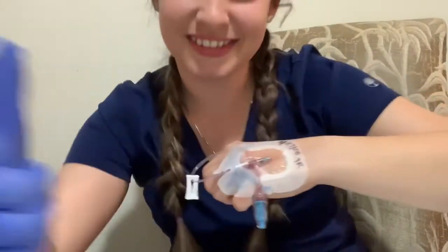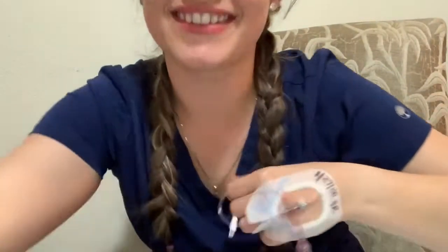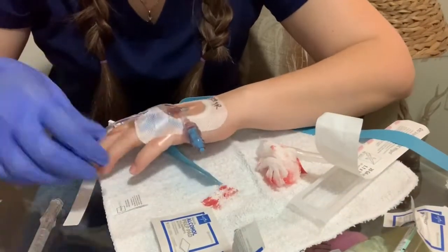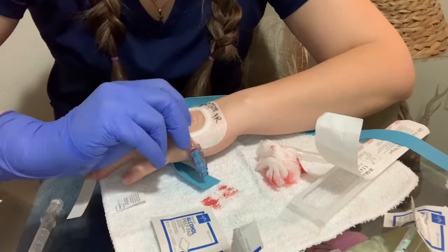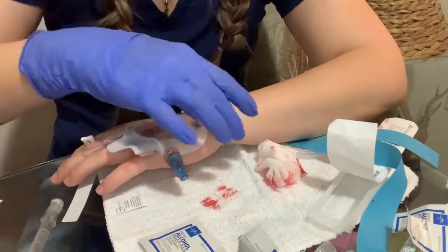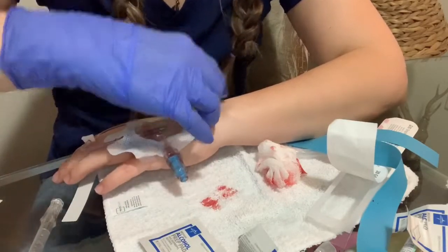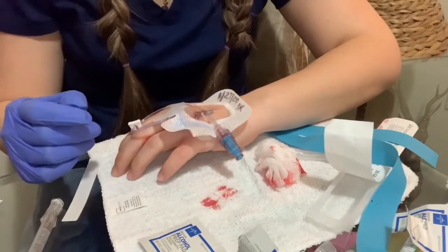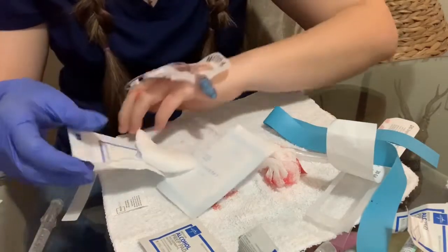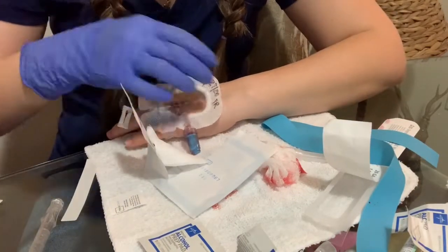I'm very happy — I think I did a good job! Now I'm gonna show you how to take the IV out. For that we're gonna need alcohol swabs, a gauze 2x2 or 4x4, and clean gloves.